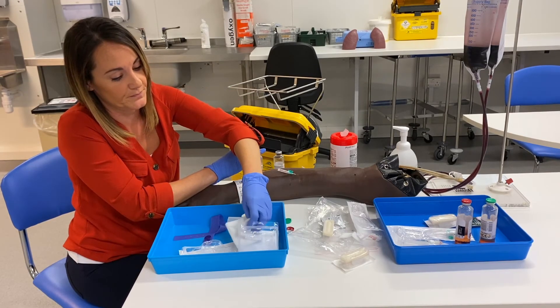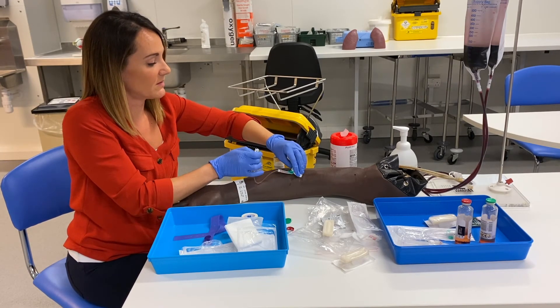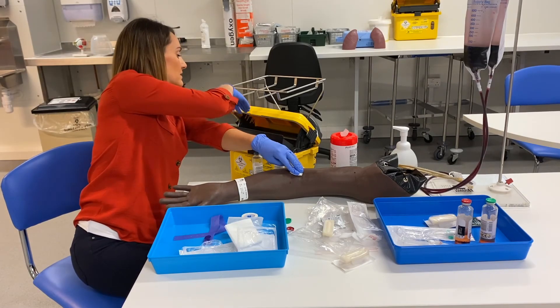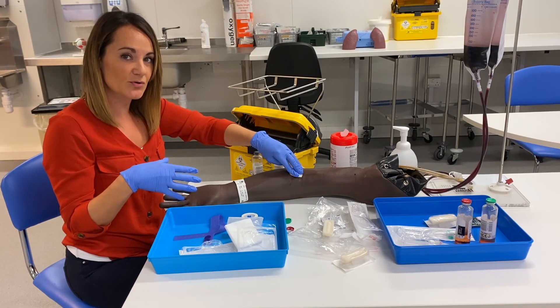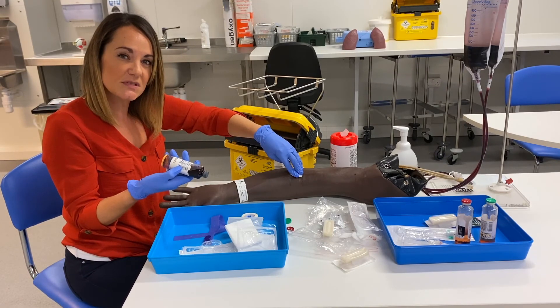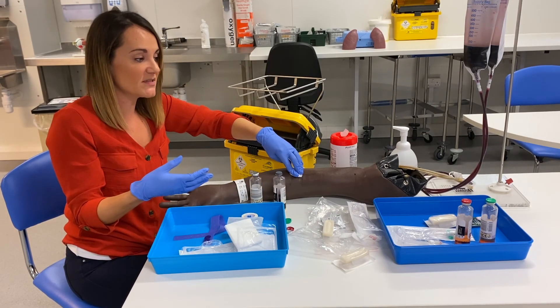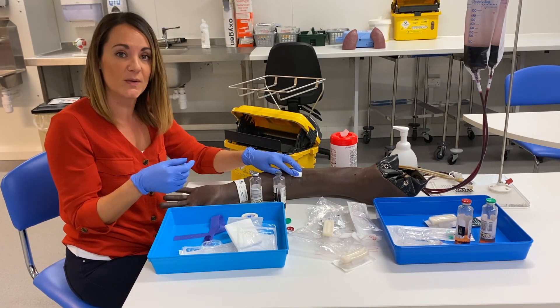Get your gauze, press it down there, activate your safety device, and straight into the sharps bin. When you're done, it's really, really important to label the cultures at the patient's bedside by signing the form. There are also little labels at the side that you peel off and stick on that bit of paper as well. They can go straight down to the lab. If it's out of hours, there is almost like an incubator at the pathology entrance door, and they go in there. Thank you very much.